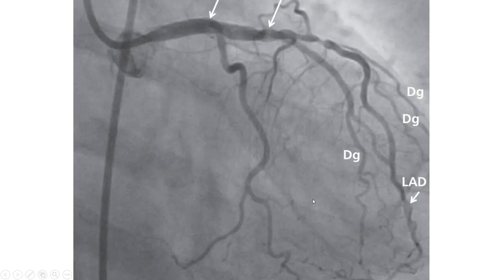More practice. This image as well, we have said that we cannot see the diaphragm, so that makes it caudal, and the relation of the tip of the catheter is right towards the body of the catheter, so it's RAO caudal view. So if it's RAO caudal view, the circumflex is expected to follow the intensifier in this setting. So you can find that caudal is down, this is the circumflex, and it's right compared to the LAD. So this is the left main stem, circumflex, and there's lots of overlap in here, but this is the LAD.